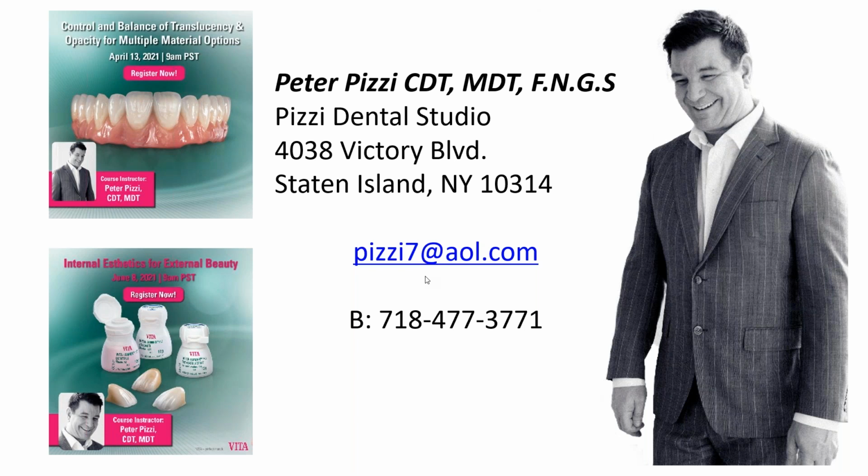What I mean by that, my 1M1 was really close in value. Okay, great. But it was a very translucent tooth. So I'm thinking that I need to finish with translucency. I might not use 1M1 inside. I might use OM3. I might use OM2. I might use something a little brighter to pick up the value because I'm going to lose some of the value with my translucency. So value is really more about not black to white.